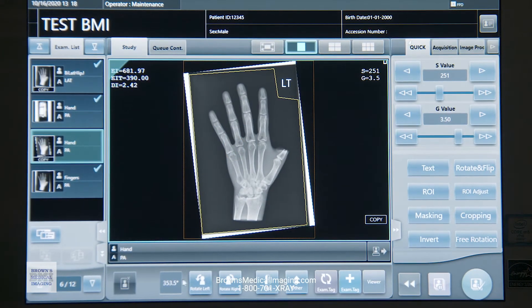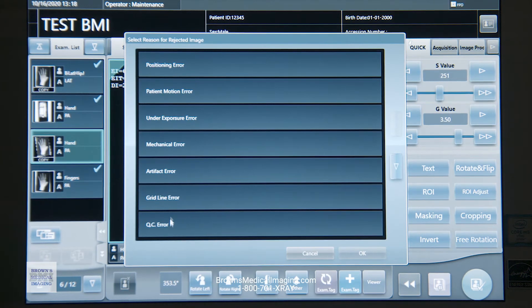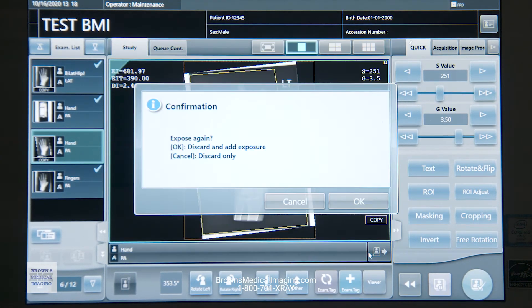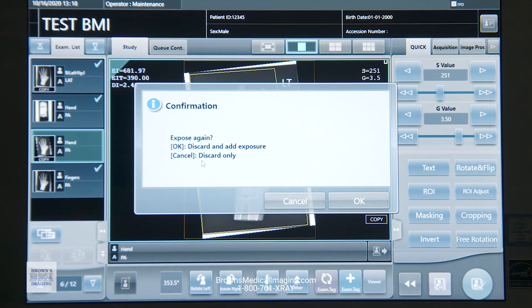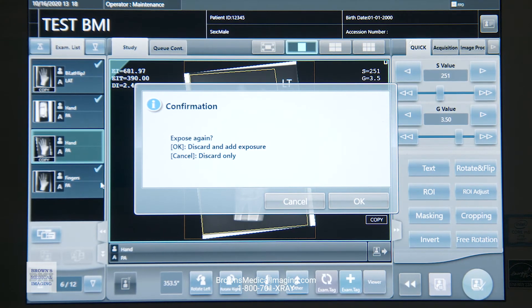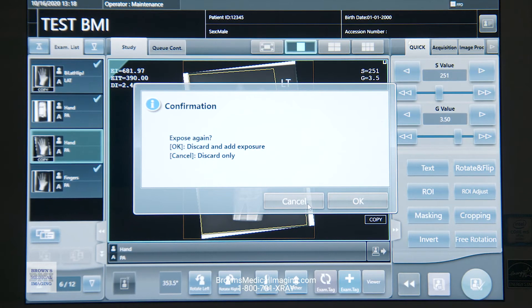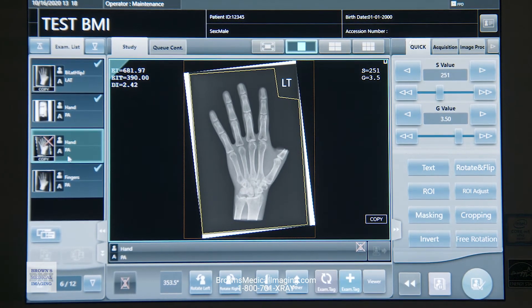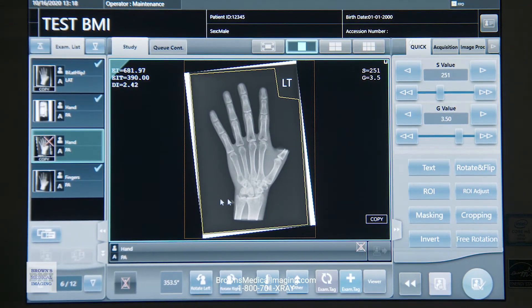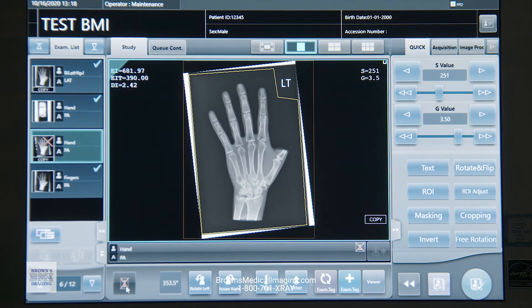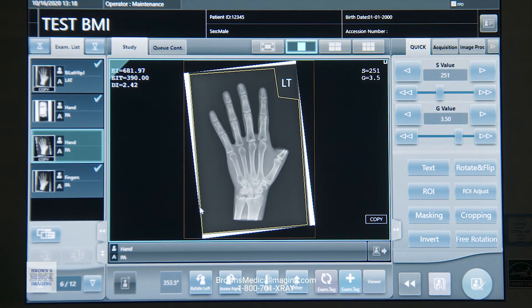If I want to reject an image, all the way over here at the bottom left, we hit our reject button and select a reason — let's say QC error. It's going to ask me, do I want to expose again? If you do, hit okay and it's going to add another exam tag ready for you to shoot. If you've already made that second exposure, we can just hit cancel. It'll still reject that image — puts a red X over that thumbnail, which will not send to PAX. If I want to get that image back, that same reject button — if I click on it again and hit okay — will cancel the reject and I get that image back.